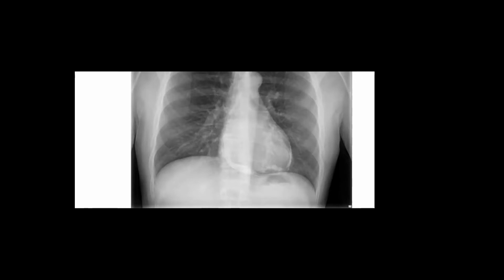Yes, this is pericardial calcification. I forgive you if you don't, because the AP and PA orientation might miss the calcification, and lateral is much better. So when you want to see the calcification best by X-ray, choose lateral. Okay, lateral will show it better. But if you have to choose from all cardiology imaging modalities the best to evaluate for calcium and pericardial calcification, which one are you going to choose? Cardiac CT. Cardiac CT, exactly.